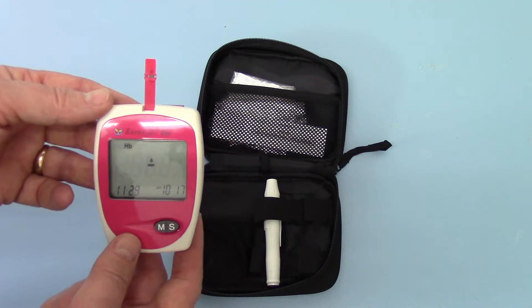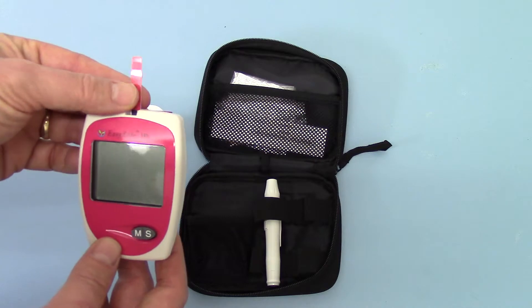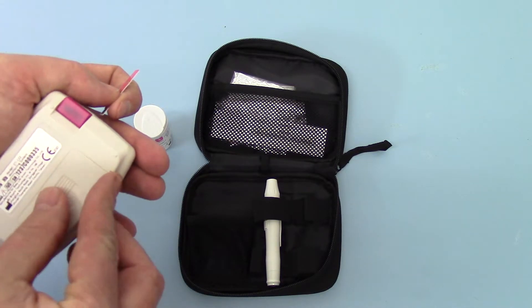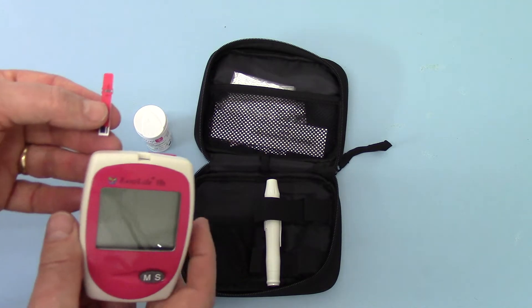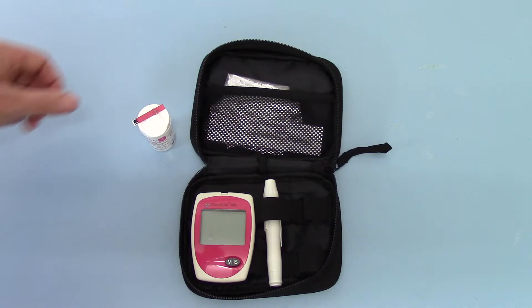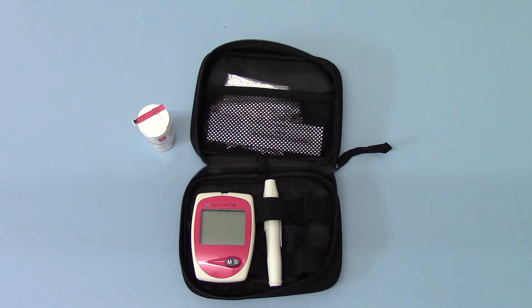So that is now ready to go for the first test. I'm just going to remove that to power it down. It automatically powers up each time you pop a test strip into it and will power down automatically. So that is the setup completed on the EasyLife haemoglobin meter, and the next thing we're going to show you is a procedure for running a test.